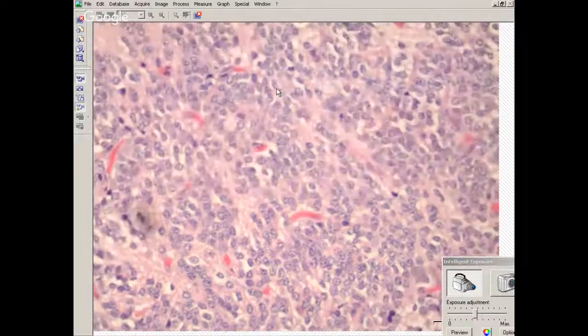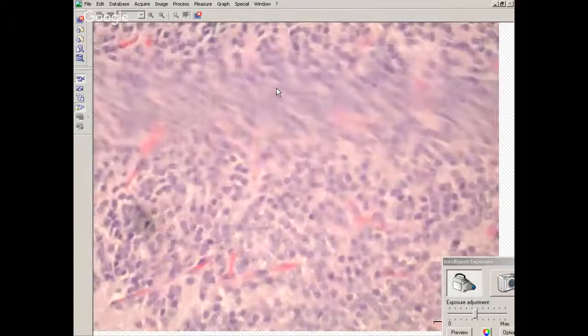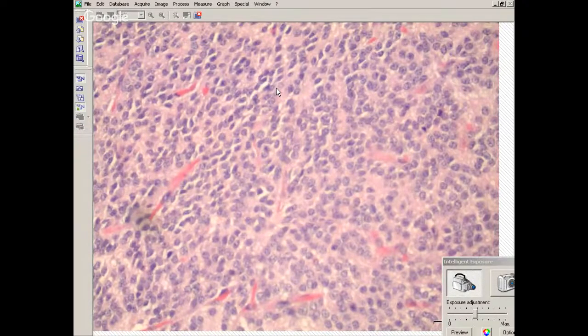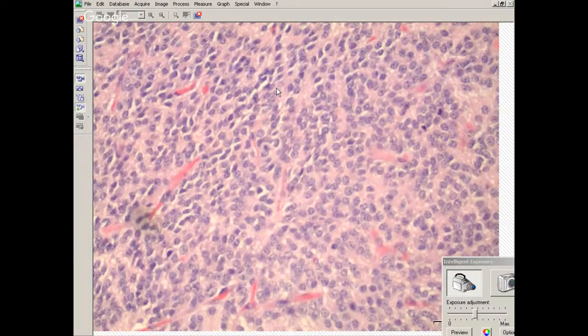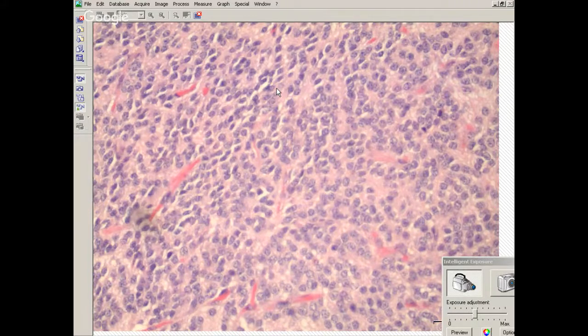Okay. Sure. So what would the differential be in a situation where there's a tumor in the ventricle in the first place, irrespective of whether or not you saw something like this? What is the differential for intraventricular tumors? Ependymoma to start with. What other things? There's at least one other thing that you would want to think of. Neurocytoma, and there's one other thing that comes to mind. Choroid plexus papilloma. Those are the main things.